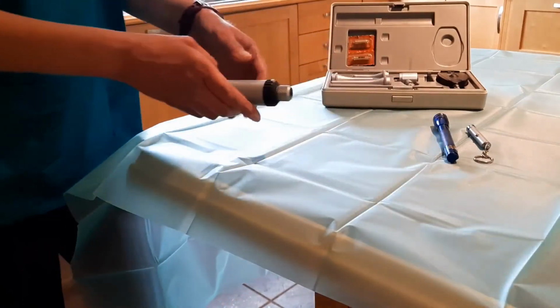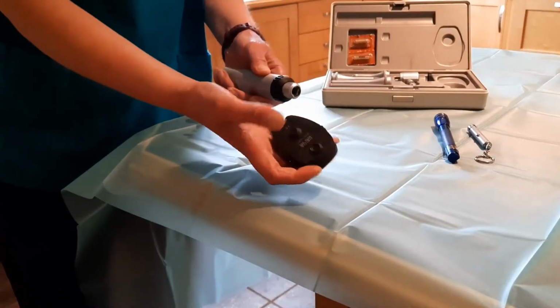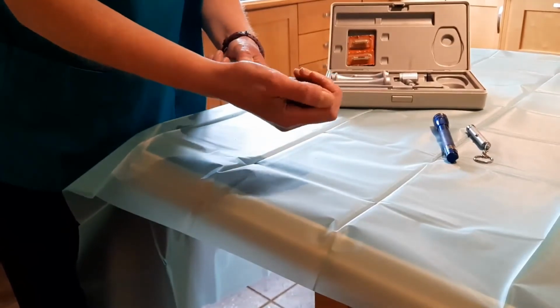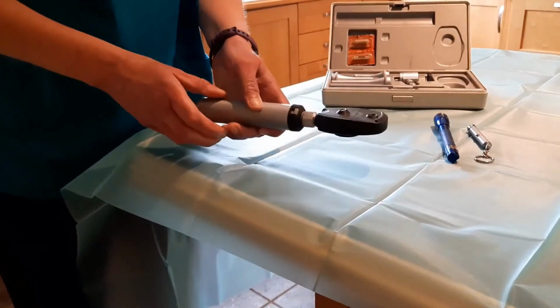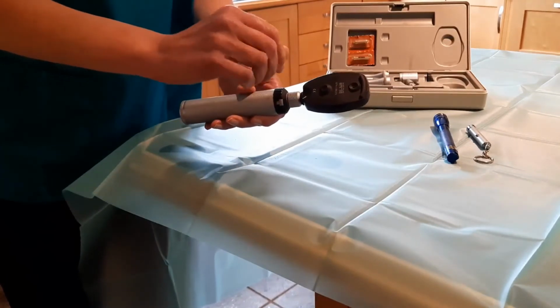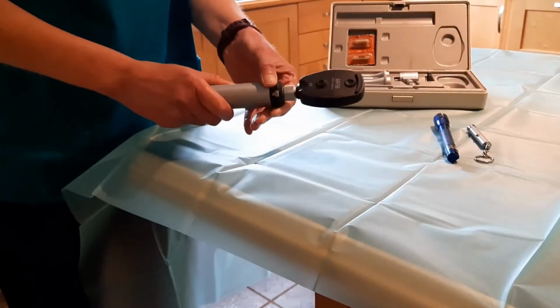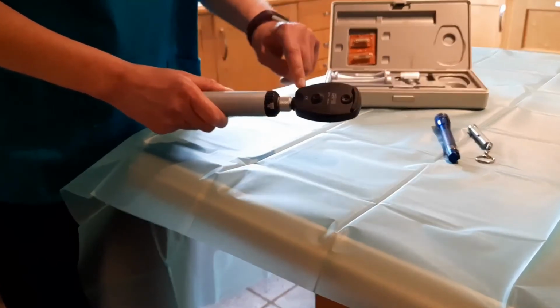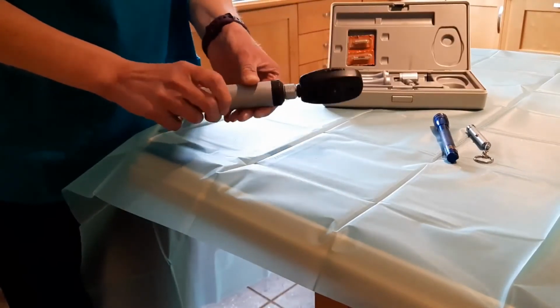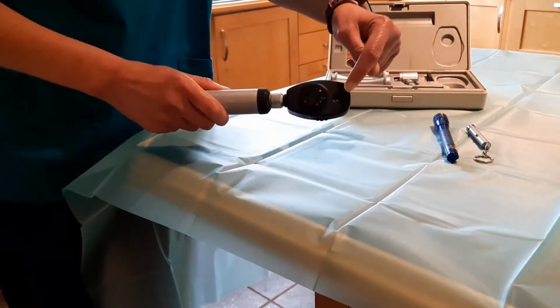So to examine the eye, we use an ophthalmoscope. So we'll take the ophthalmoscope head and click it into place. In some models, you'll see a little tightening screw here that allows you to hold that in place. Switch on and off by rotating the on-off switch. This side faces you, and this is the side that faces the patient, and a beam of light is emitted from this window.